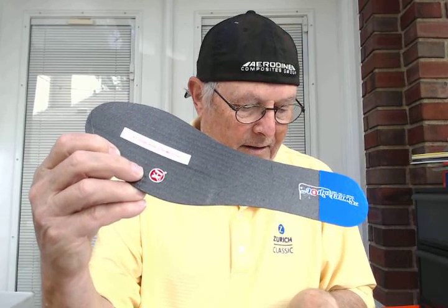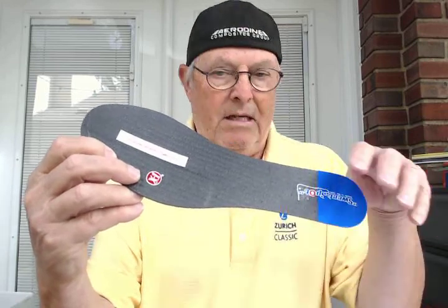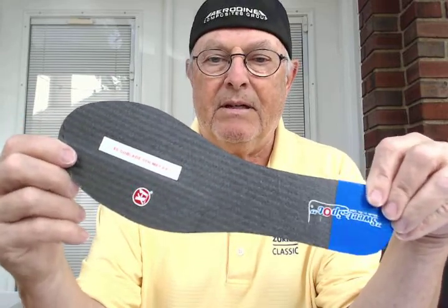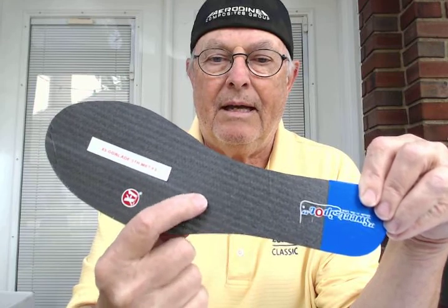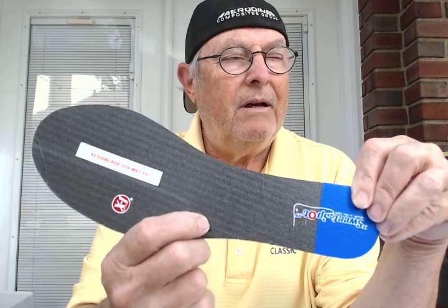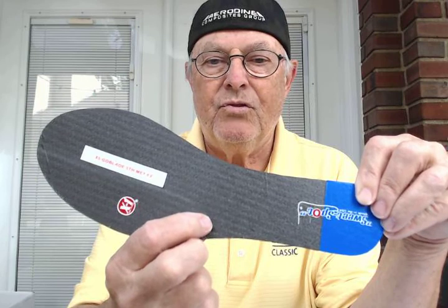He had a fifth met fracture of the head on his left foot and it was repaired surgically. He does some sports, he says. The X5 is a little different than all my other blades — it's specifically made for fifth met fractures. We do a little buildup under the fifth metatarsal, which unloads the head where he had the surgical repair. That's pretty indicative of somebody that plays basketball or gets a little discomfort after surgery. This unweights it just enough — it's about three thousandths of an inch buildup there.